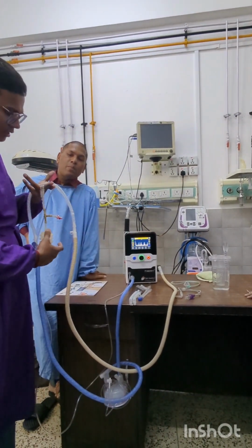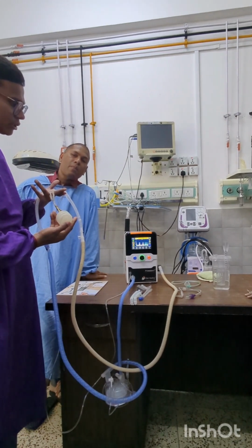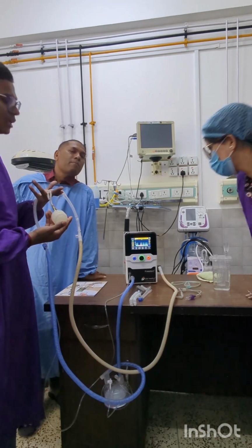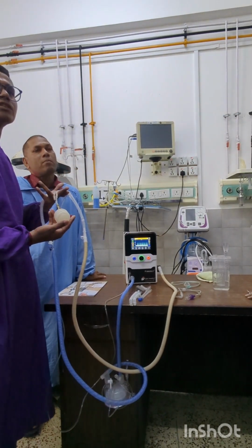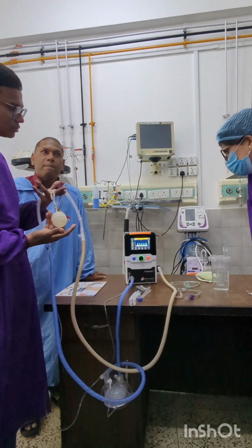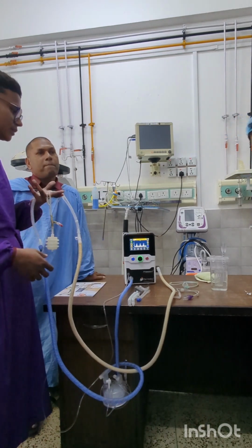If the baby tries to trigger spontaneous breathing, the machine will allow it and synchronize each and every breath. It is also color coded, so you can identify which are the machine breaths and which are the patient-initiated breaths.